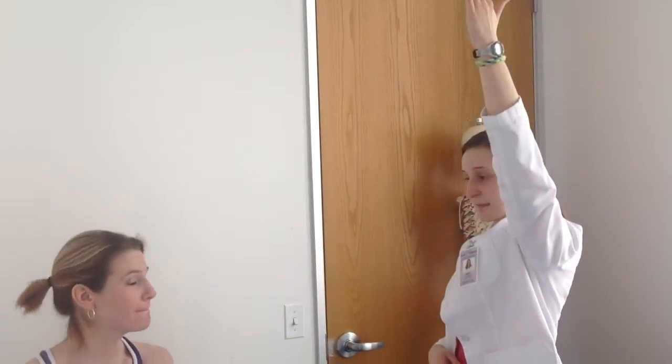Hi Tracy, my name is Callie and I'll be your PT today. How are you doing? Hi, I'm good. How's the shoulder? A little bit of pain. Okay, so today we're just going to do a test to see how the shoulder's looking and how it's moving. So I'm going to have you raise your arm above your head, and we're going to have your thumb point toward the ceiling on the way up, and then it's going to point behind you once you get up there. Okay. That make sense? Mm-hmm.